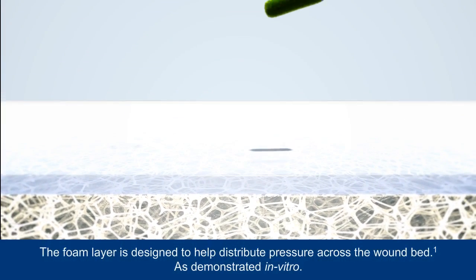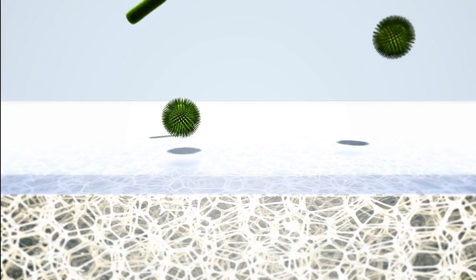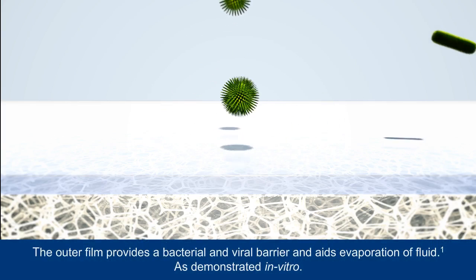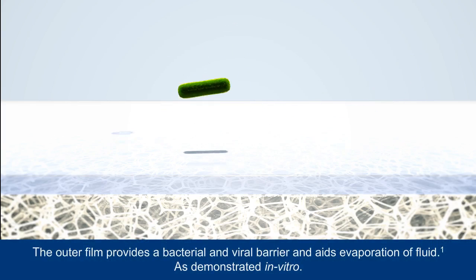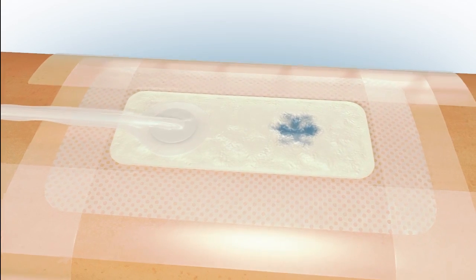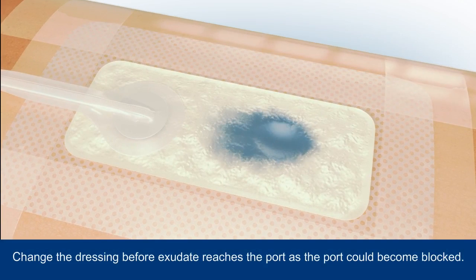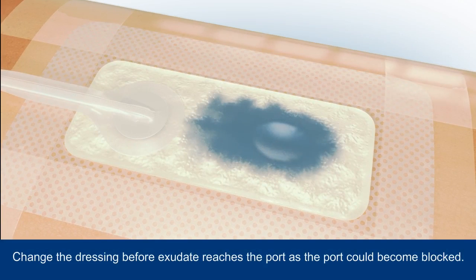The foam layer is designed to aid distribution of negative pressure across the dressing and to the wound bed. A showerproof top film provides an effective bacterial and viral barrier, in addition to aiding evaporation of fluid. Exudate will initially be absorbed into the dressing directly above the wound and then throughout the dressing, locked away in the hydrofibre core.